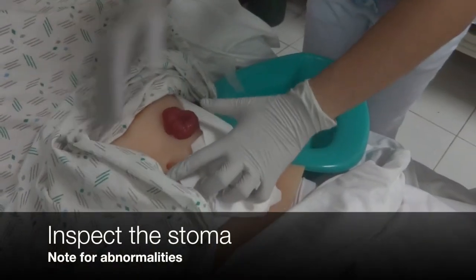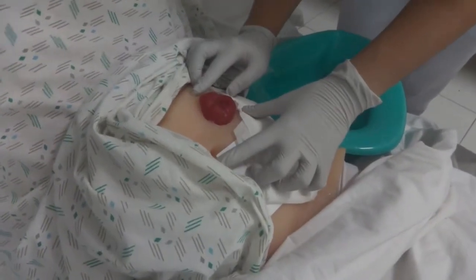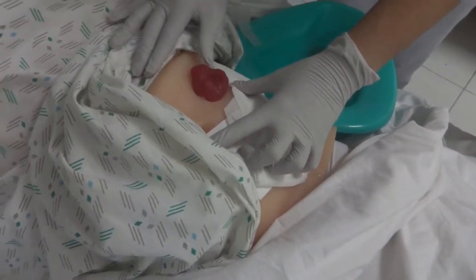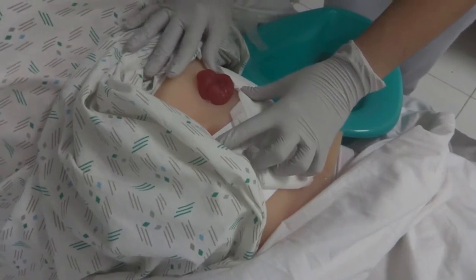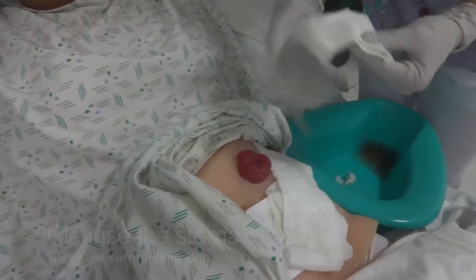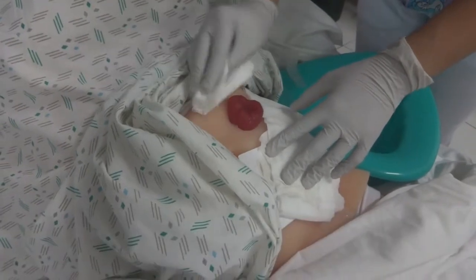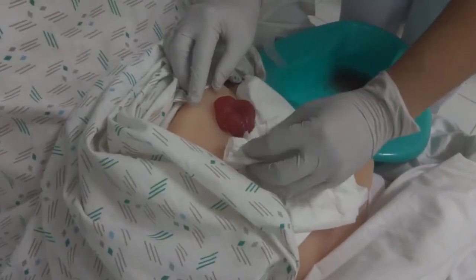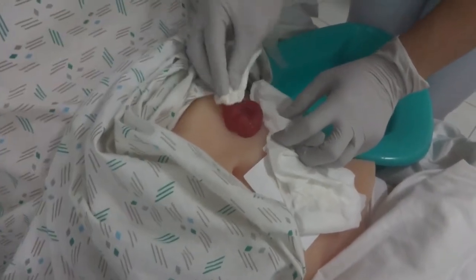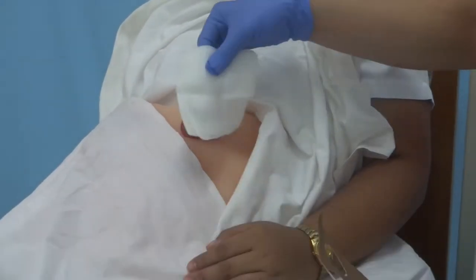Next, inspect the stoma and peristomal skin. It should be pink in color, moist, and not bleeding. Note the location, color, swelling, trauma, or healing irritation if observed. Report to the physician for any excess bleeding. Use warm water and mild soap to cleanse the stoma and surrounding skin. Allow the area to dry. Place a clean 4x4 gauze pad over the stoma.